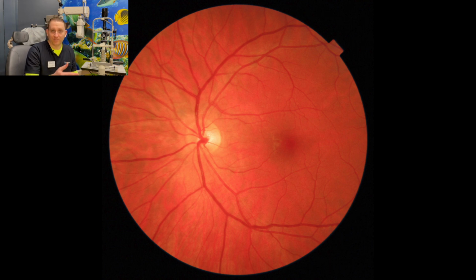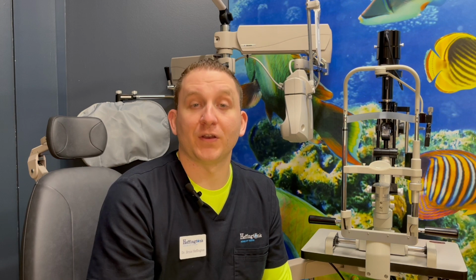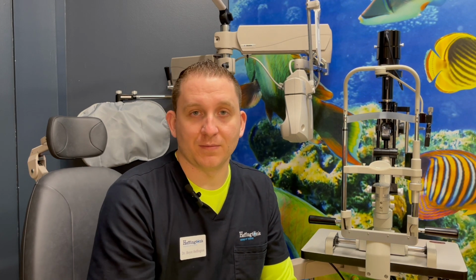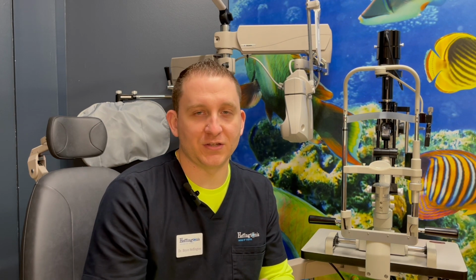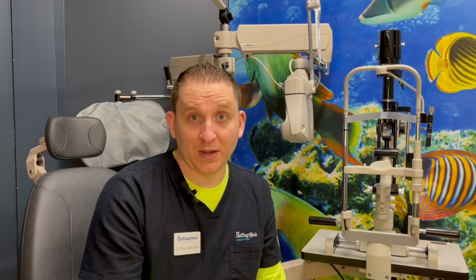So the optic nerve, blood vessels coming out of the optic nerve, the macula, the retina, the retinal arcades, retinal vasculature, all of that is the left retina and what you see in the back of my eyes. But these, by definition, are fundus photos, which is what we use a lot of times to monitor conditions of health changes, concerns, diabetic retinopathy, glaucoma, macular degeneration, bleeding in the back of the eyeball, blood in the retina, retinal detachments, anything of that nature is what we like to use fundus photography for.